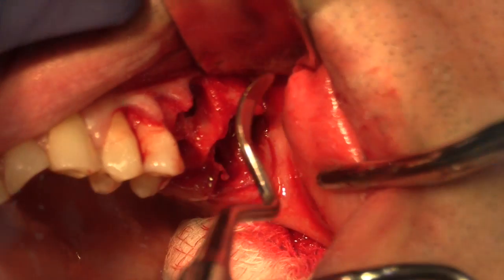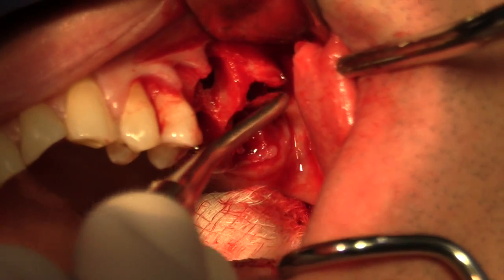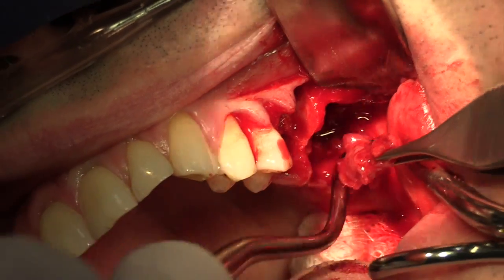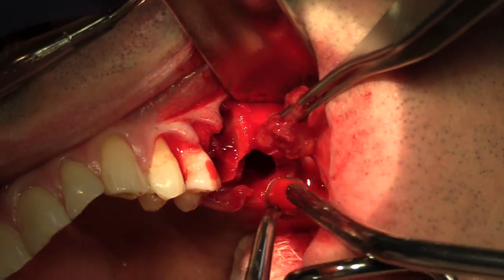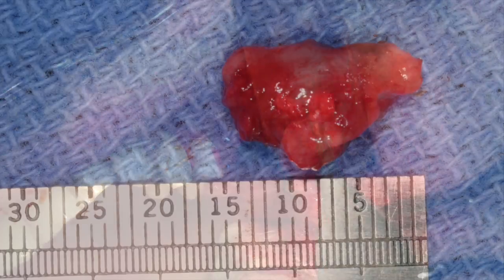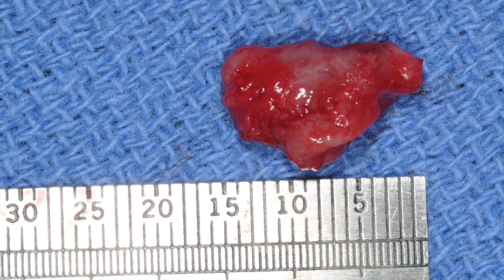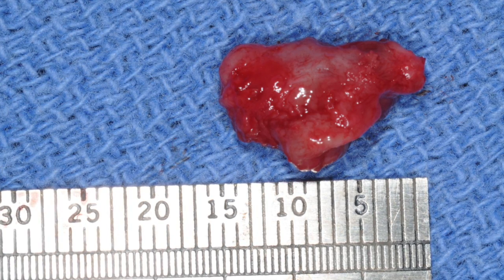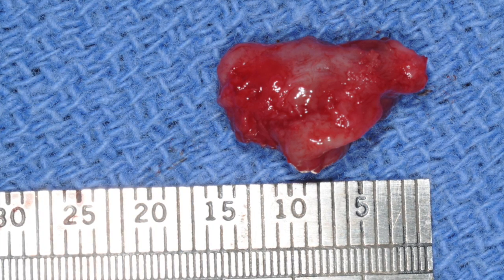For this, I'll use a range of curettes and sinus lift instruments to gently enucleate the cyst and remove it completely from the site. We recall that the cyst, as it was biopsied initially, was an odontogenic keratocyst, which can have a higher incidence of recurrence. Hence, in this case, it's important to extract the teeth and perform a peripheral ostectomy to remove the associated daughter cells that might be present.